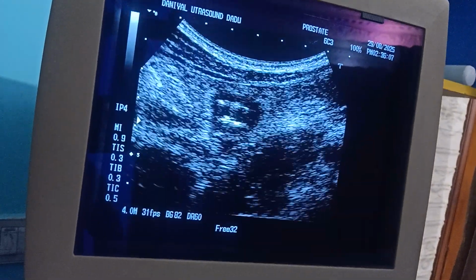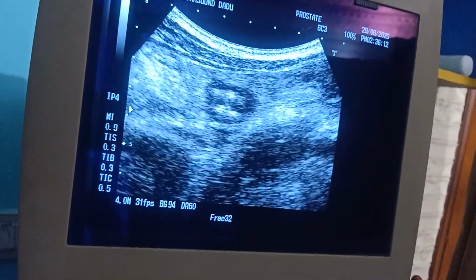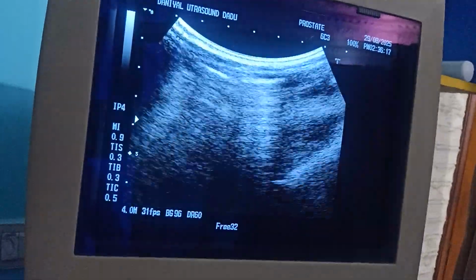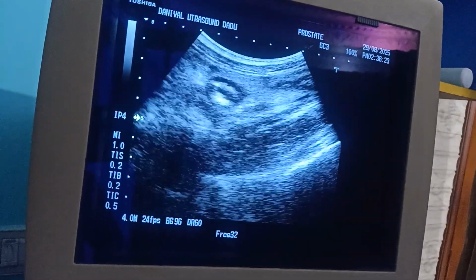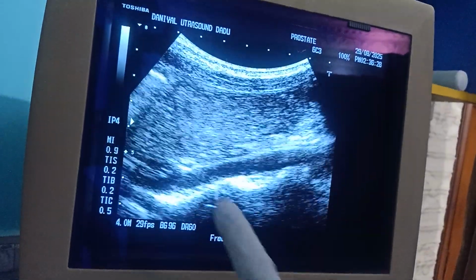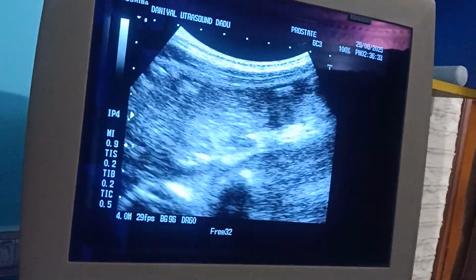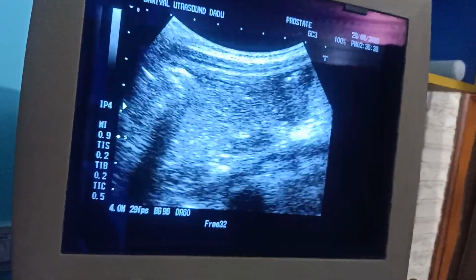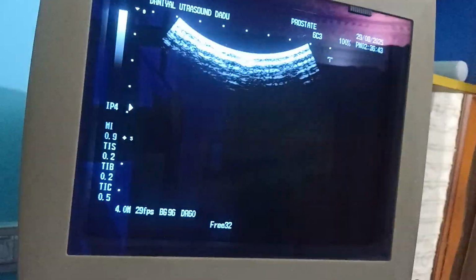So here is the gut pathology, which is showing smoothly walled hypoechoic guts in the right ileocecal region. Whole segment has been involved. Another thing to know now, the associated findings: the rest of the guts, this is the segment of the gut which is moderately distended, showing to and fro motion of the gut contents, moderately distended guts all over the abdomen.